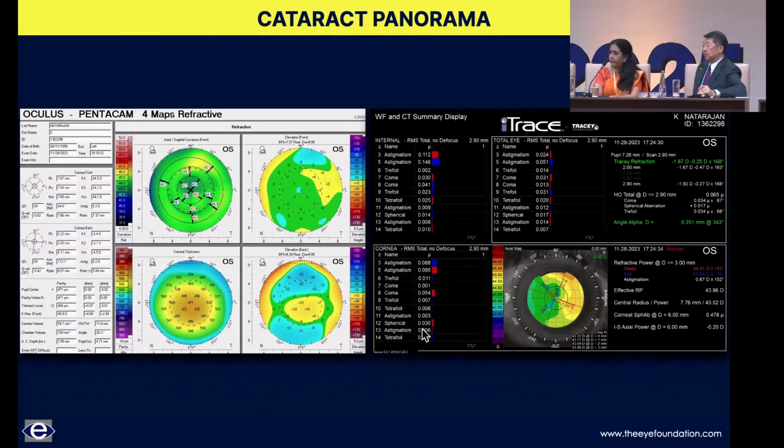So I'll tend to do something like the Vivity, or maybe the PureSee when we get it, probably not till 2026. Because if you end up off a little bit, like a little myopic surprise, that's not bad. The little myopia they get is better near, and you can see how they are. And if you hit it and they really want more, then you could consider a multifocal in the second eye.